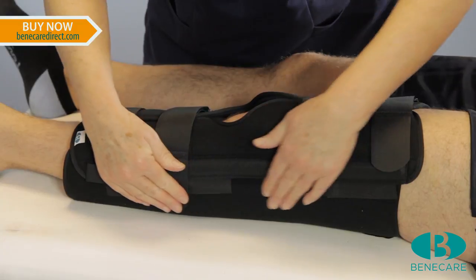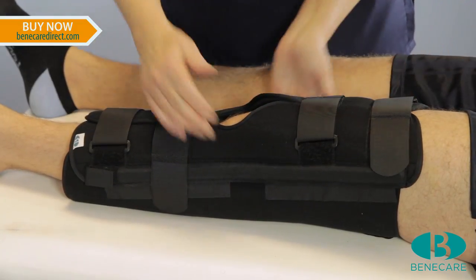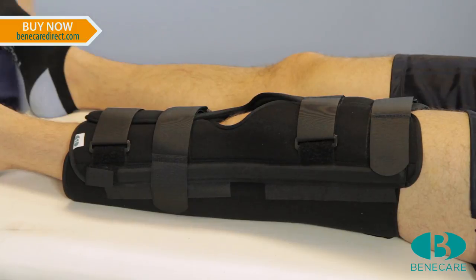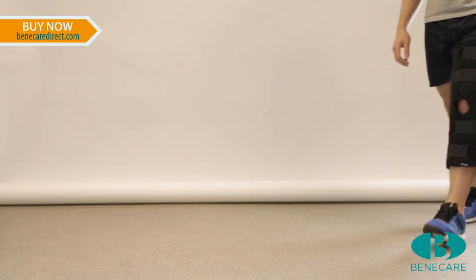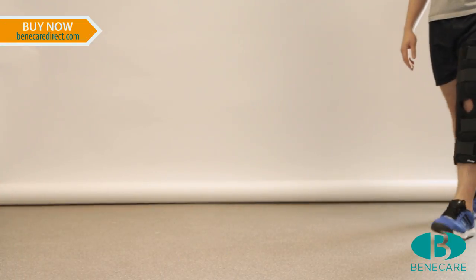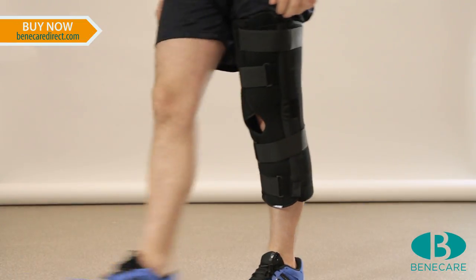Check the patient is comfortable and the splint is a perfect fit with all the hook and loop fastening systems secured. This splint can now be reapplied easily by the patient and the patient will have maximum stability to mobilise safely.